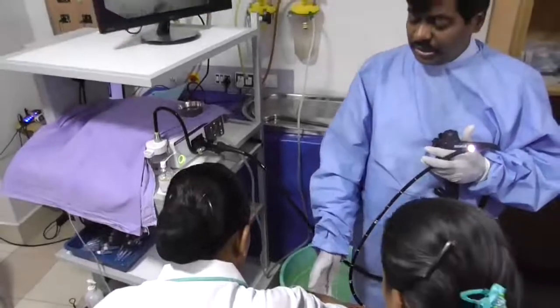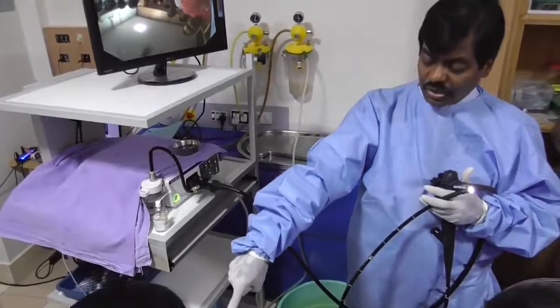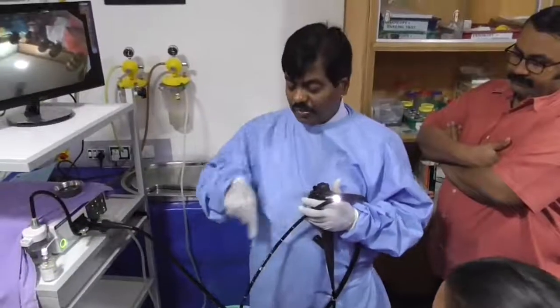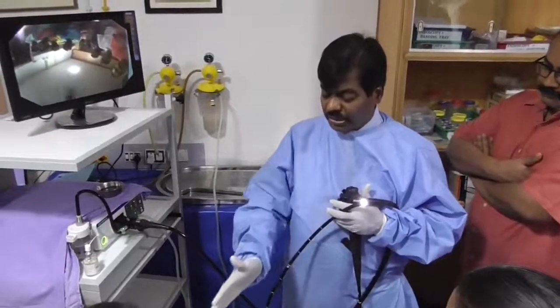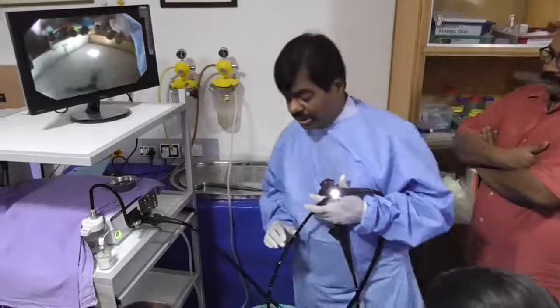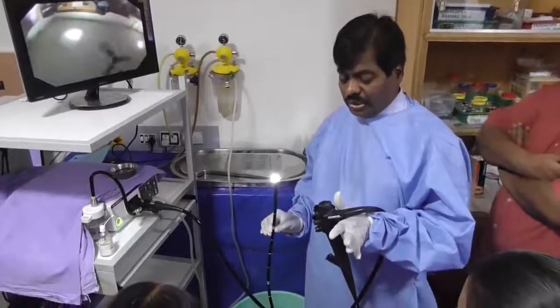The scope has to be held with a victory sign, with the hand on the occiput. There should be a restraining nurse as well — a minimum of three people along with me. See how I am posturing myself comfortably in front of the patient and how the trolley is positioned. These are all essential for good execution of the procedure. Comfortably hold the scope in your left hand.